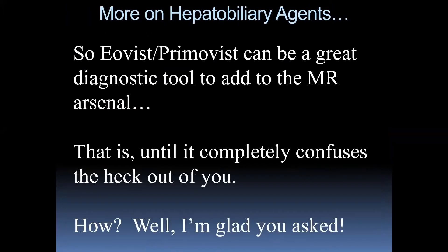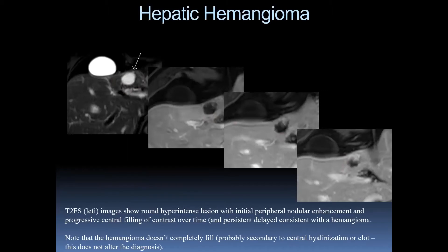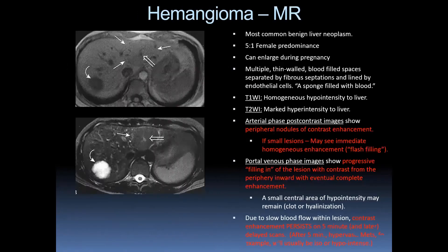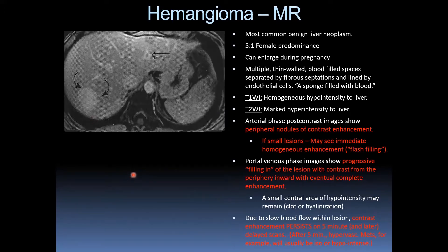Hepatobiliary agents can be a great diagnostic tool — until they completely confuse things. Here we have a T2-bright well-defined lesion with nodular progressive enhancement over time and central filling — hopefully everybody's thinking hemangioma, slam dunk. Note that the hemangioma doesn't completely fill in on delayed post-contrast images, probably secondary to hyalinization or clot — this does not alter the diagnosis. Another example: T1 dark, T2 bright, arterial phase peripheral nodular enhancement with filling in, then persistent post-contrast enhancement due to slow flow.